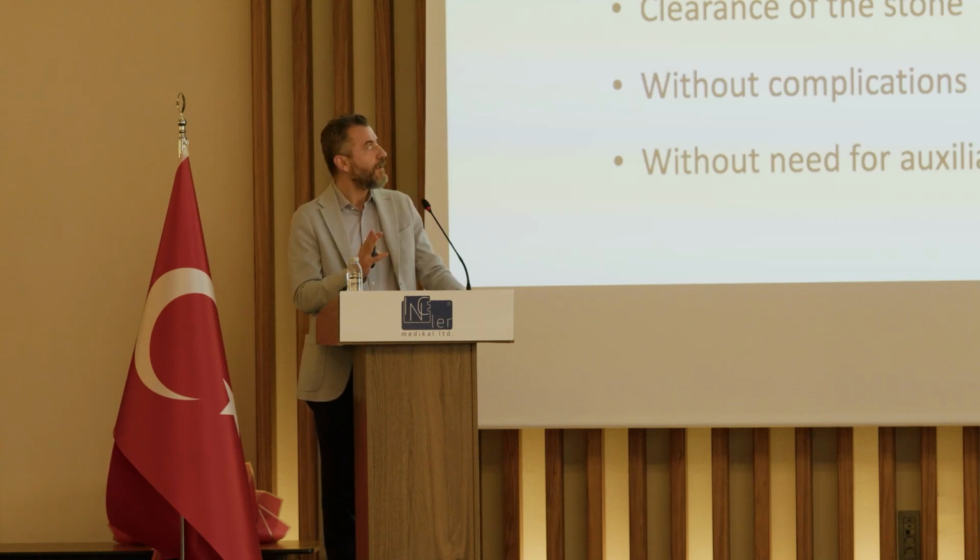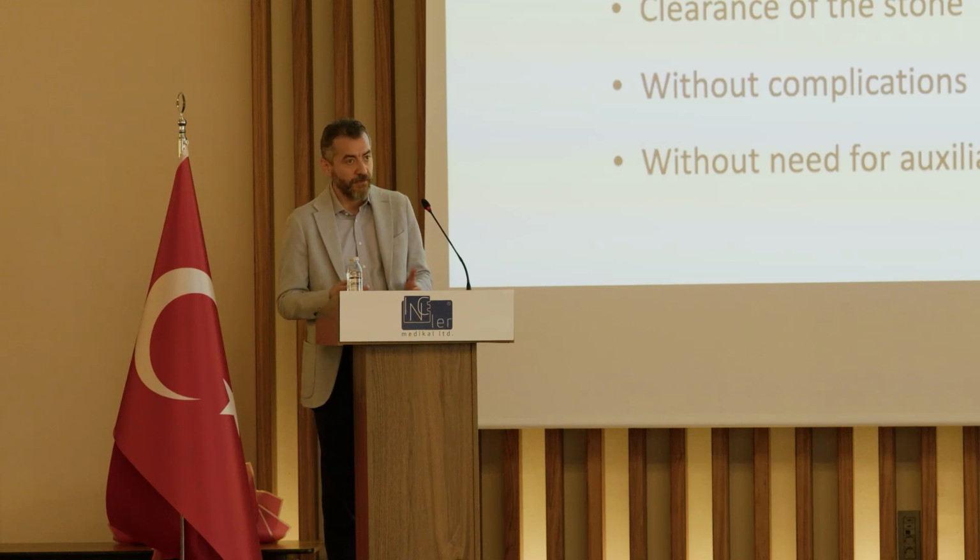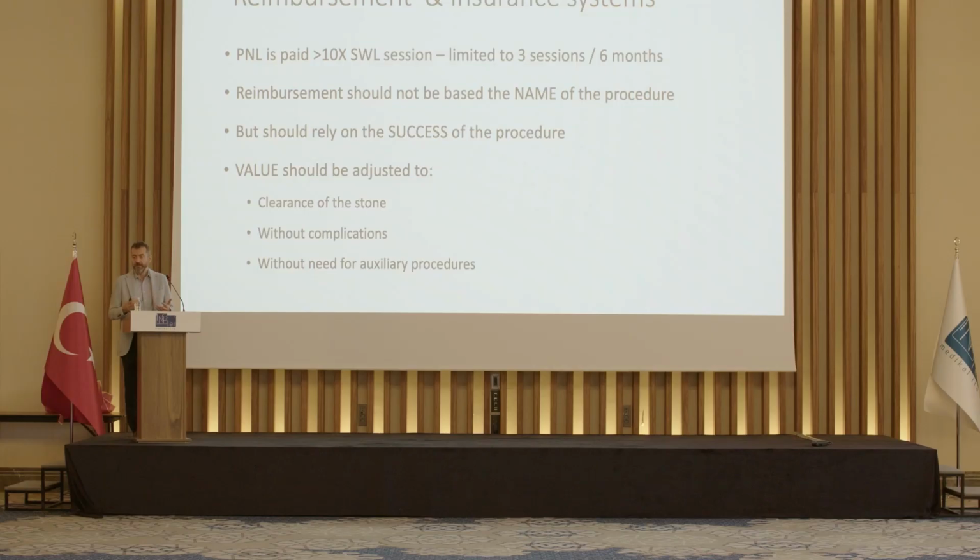And regarding the reimbursement, for shockwave lithotripsy, the amount we are paid is maybe 1 in 50 of a PCNL and 1 in 20 of a ureteroscopy. So we are paid less. That's why now physicians are selecting the urology procedures instead of shockwave lithotripsy, despite the patient will have favorable outcomes.